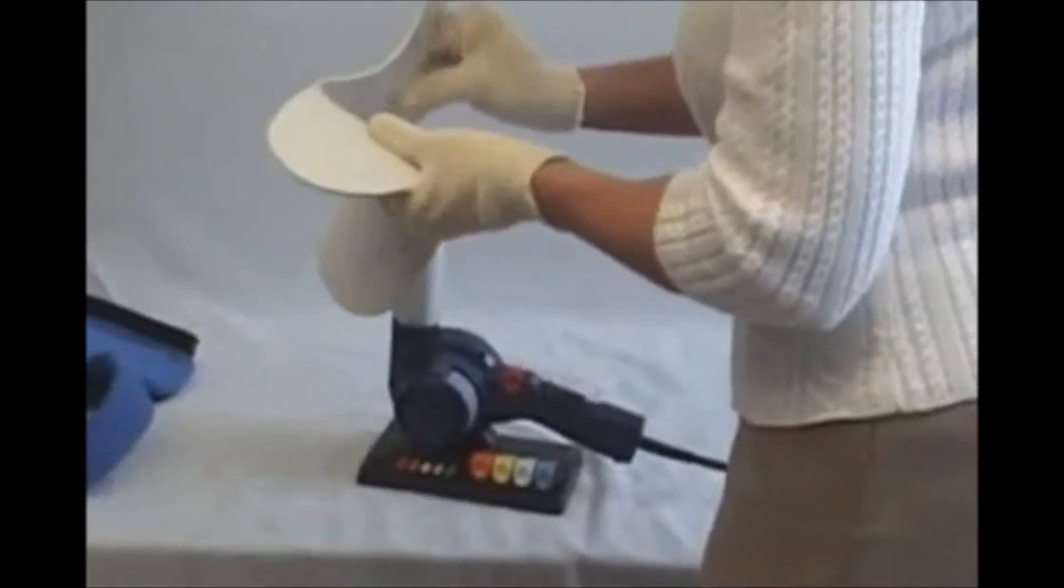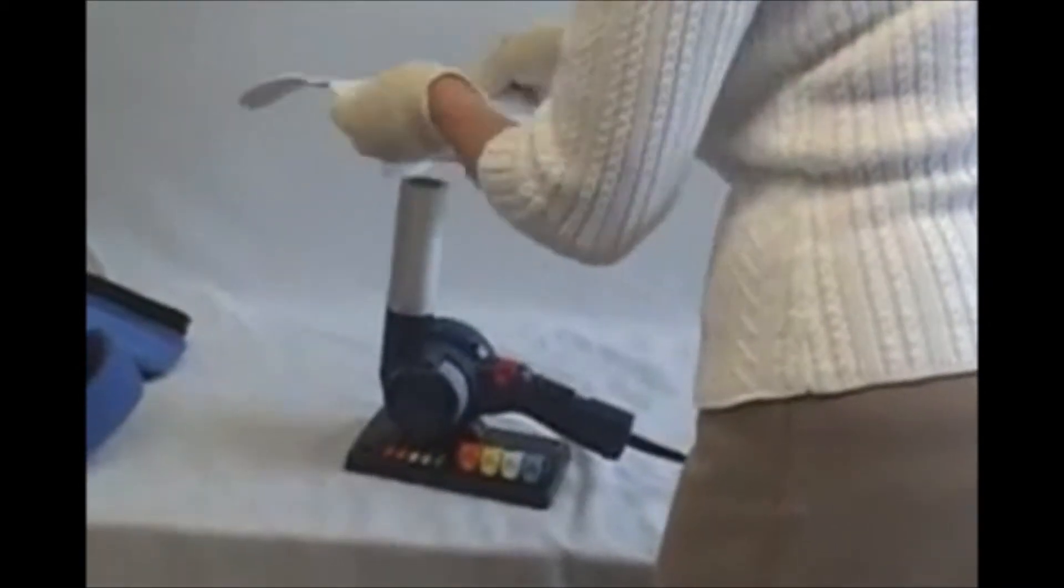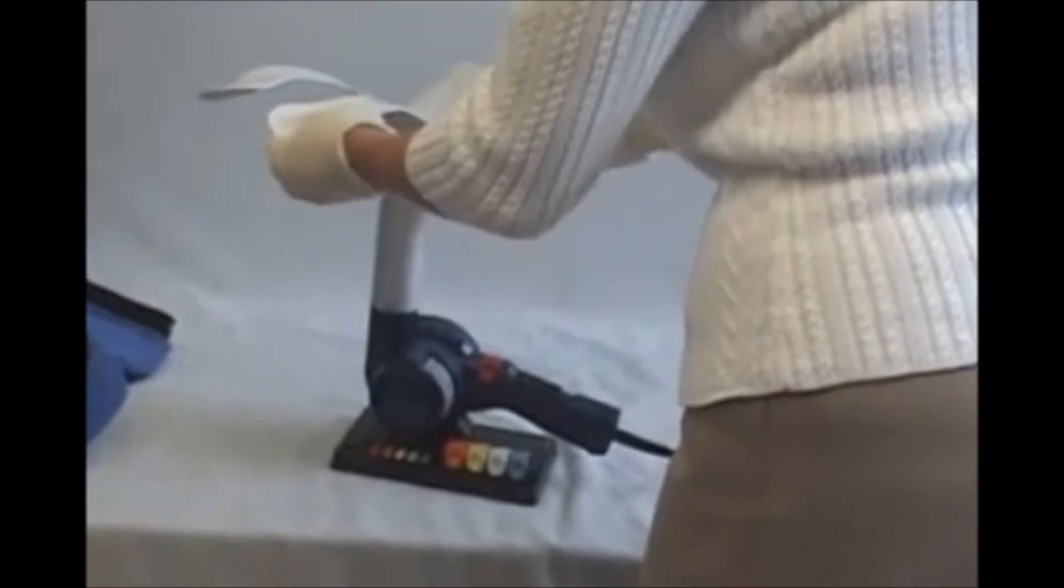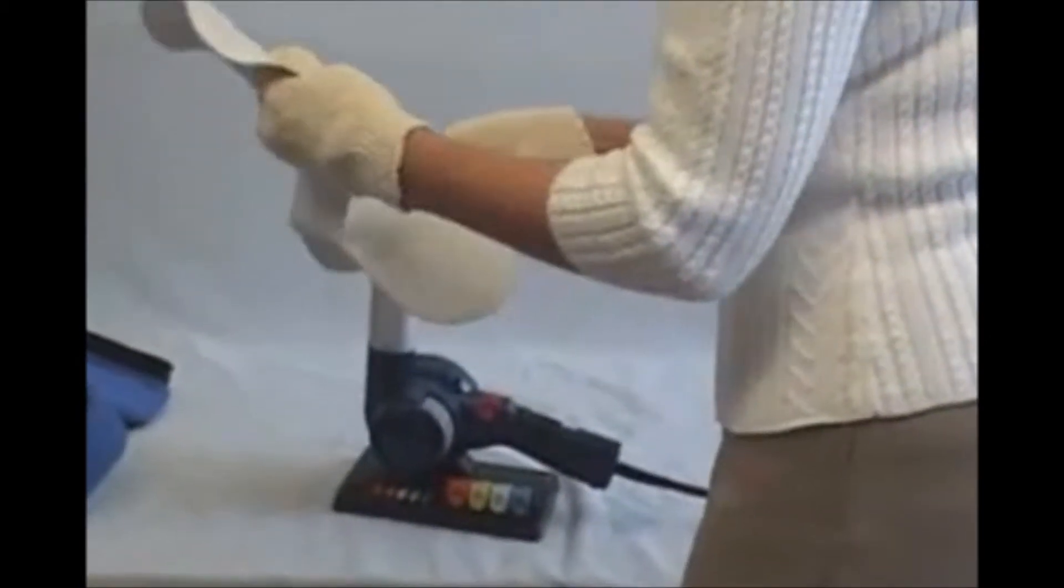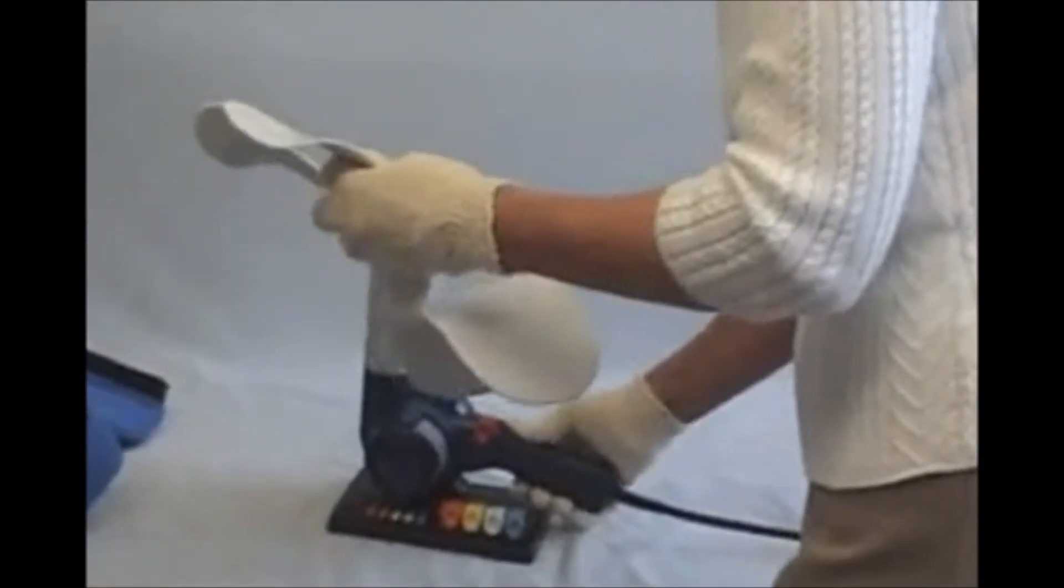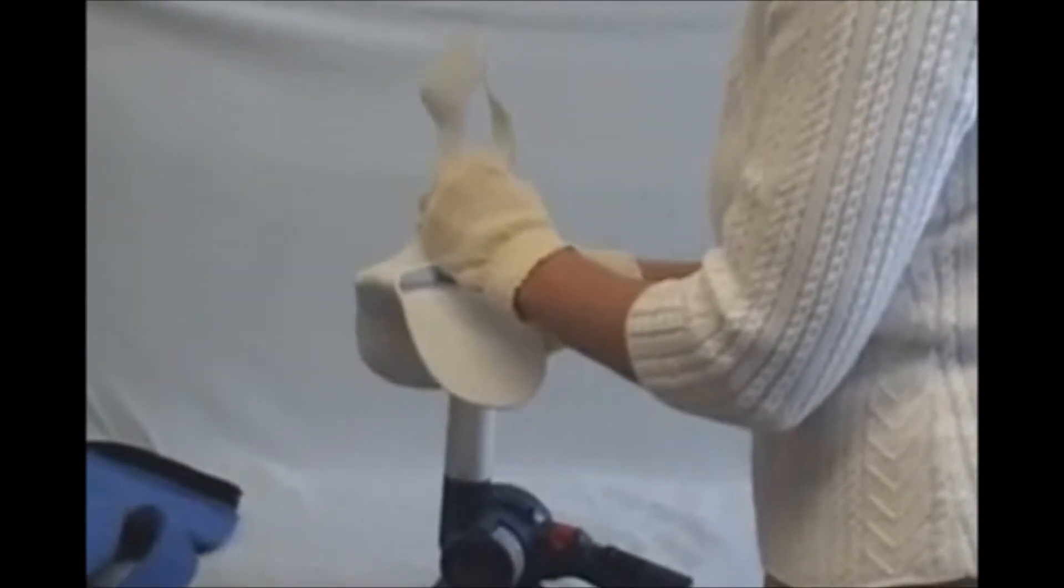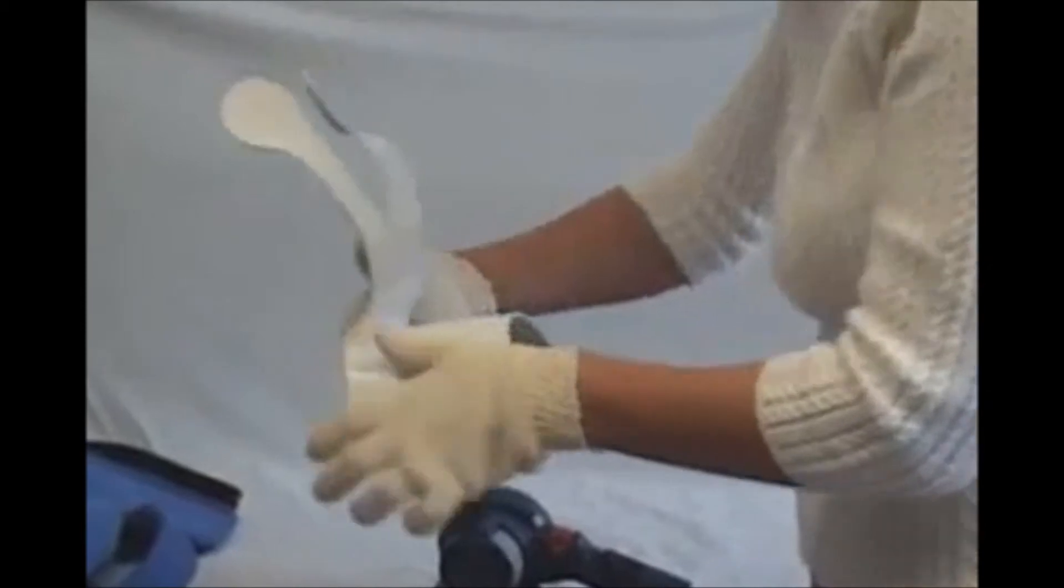I'm going to check it, mold it, and hold it to the degree that I need for my patient.